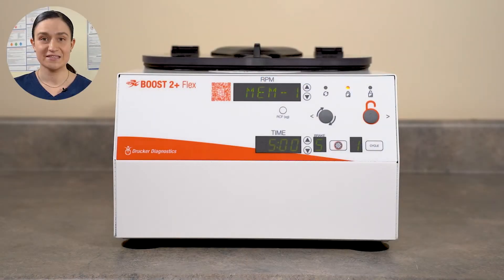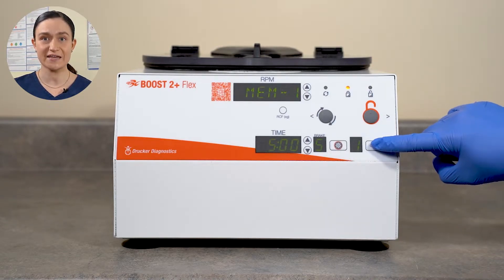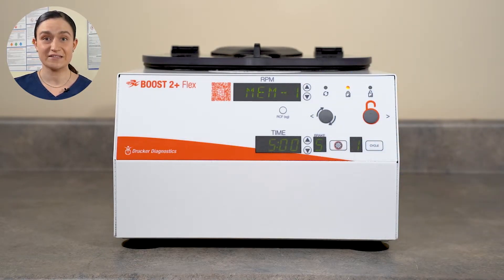The Boost 2 Plus Flex also has Single Cycle Mode. In Single Cycle Mode, the cycle button is disabled — you can't switch to any other cycle, you can't edit the cycle, and you can't add new cycles. If you'd like to learn more about Single Cycle Mode and how to engage it, you can click the video on your screen now.